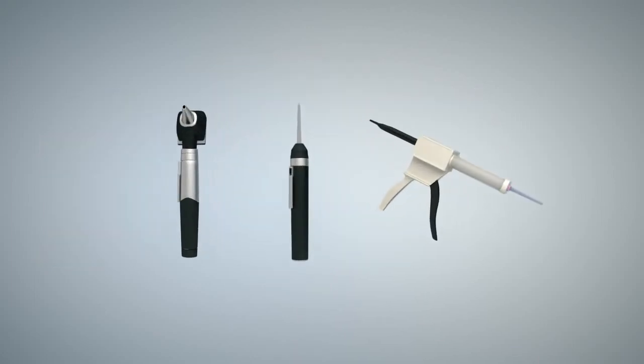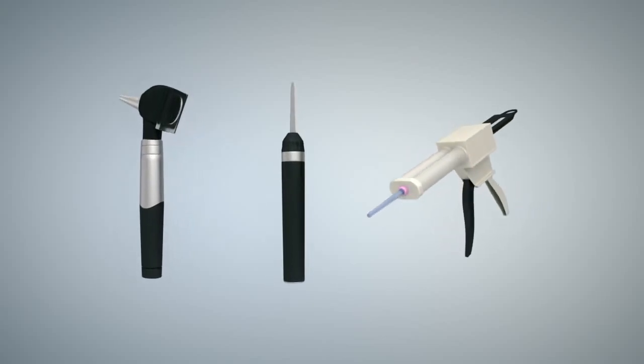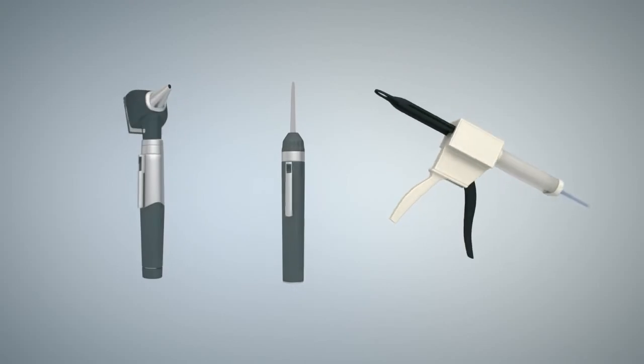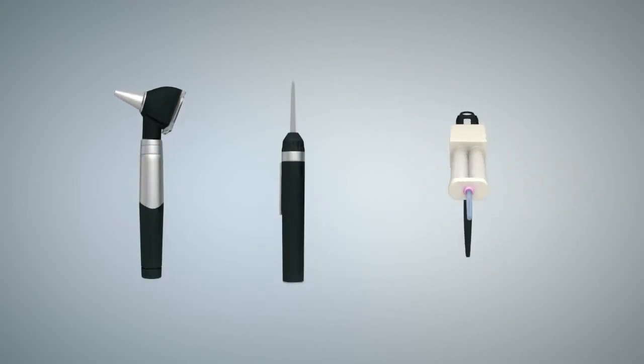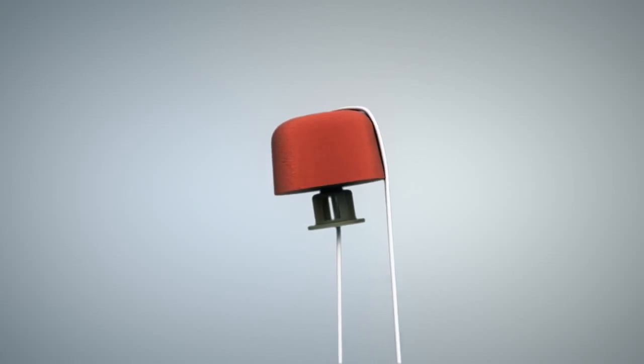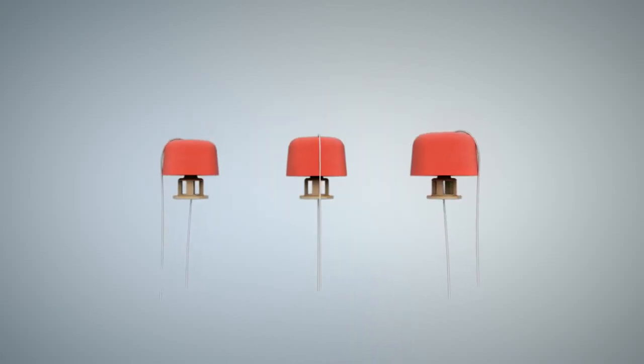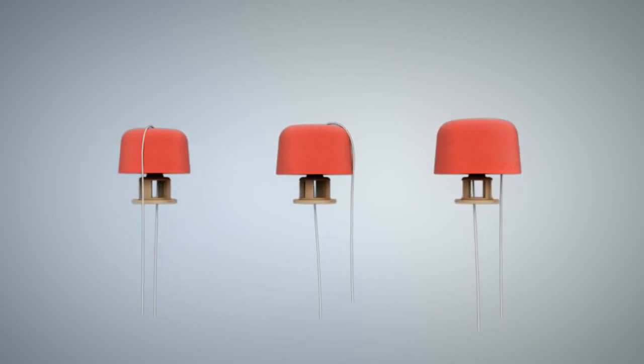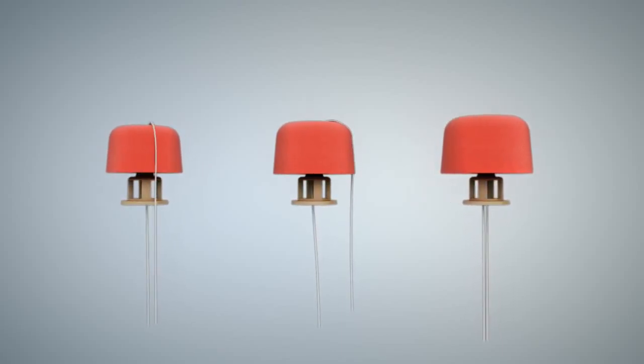Everything you need to do the job is standard equipment and commercially available, including an otoscope, a light stick, and an impression syringe. The only addition to this standard toolkit is the impression dome from Siemens with a bullet and a thread. It comes in three different sizes to accommodate different canal sizes and to ensure a safe and good quality impression.